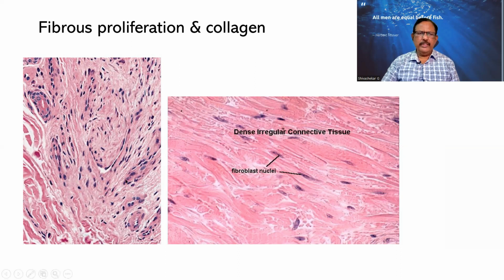On the contrary, look at this picture. Count the number of nuclei when compared to this. And here again, all the nuclei are in one direction. They are quite slender, and I will be able to make out the waviness of the tissue. So these are all fibroblasts. What cell can fibroblasts be similar to? A smooth muscle. But here it will be thinner and the nuclei more delicate when compared to the plump nuclei of the smooth muscle.